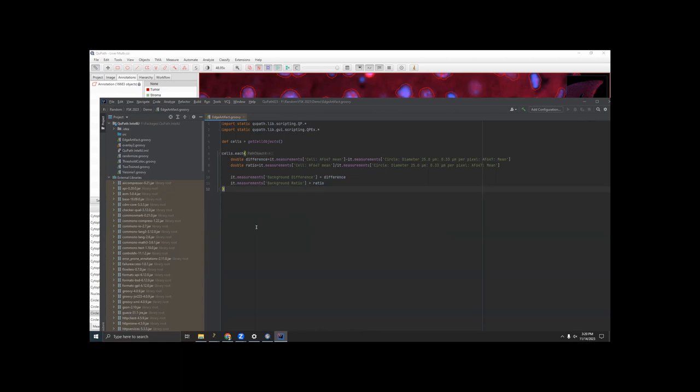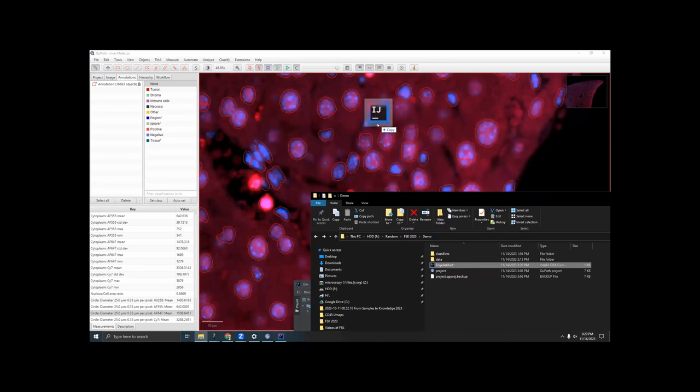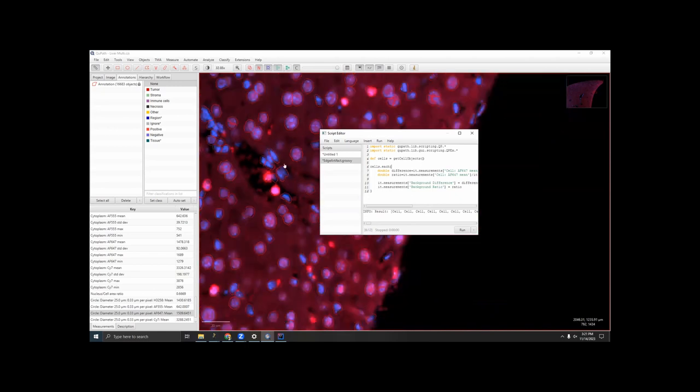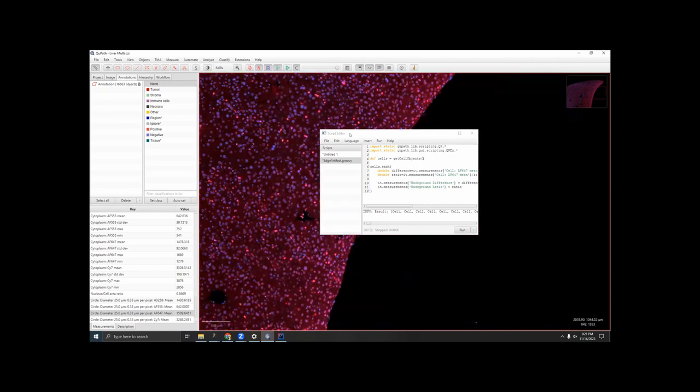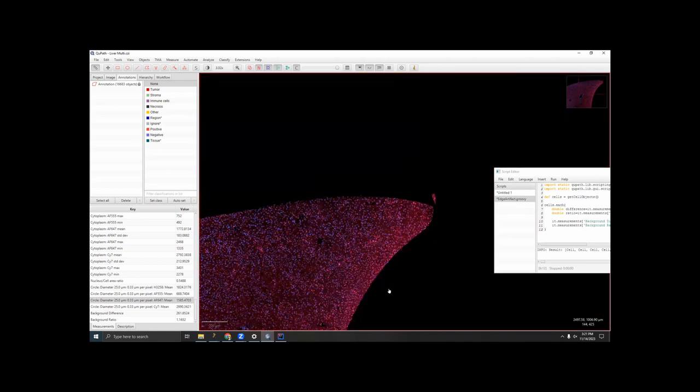Let's save this. So I've saved the file. And then I'm going to drag that file into QuPath, and it's going to open. And let's run this and see what happens. Control R to run. It runs pretty fast. So now we can click on any cell and see, yep, it's got the difference and the ratio in background.